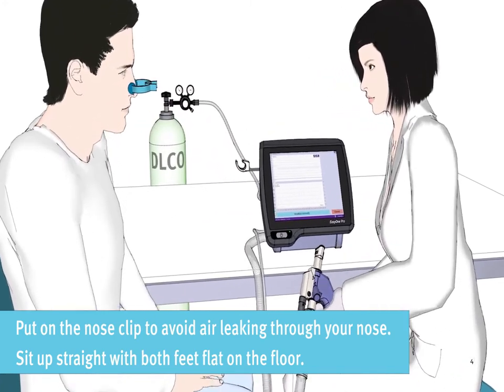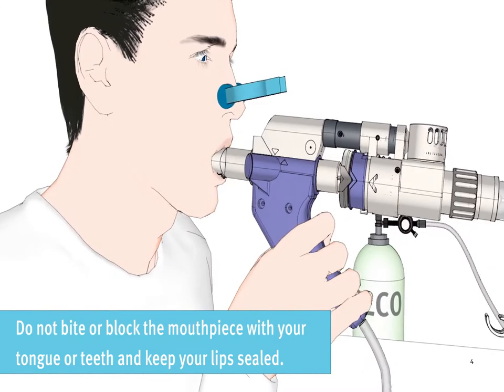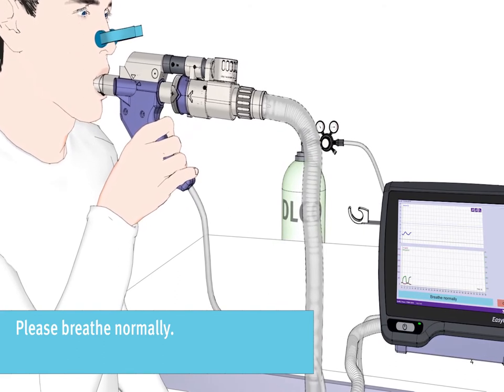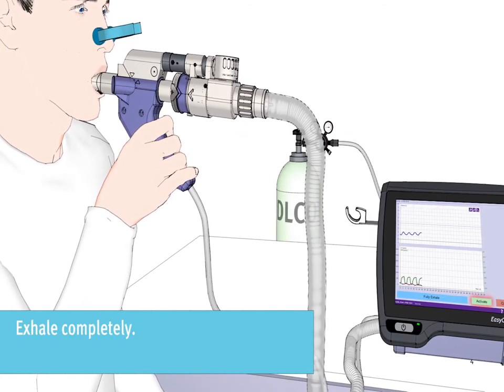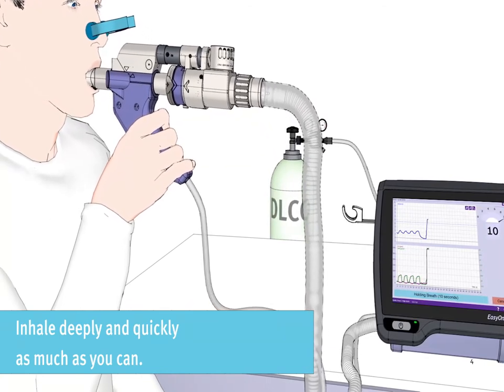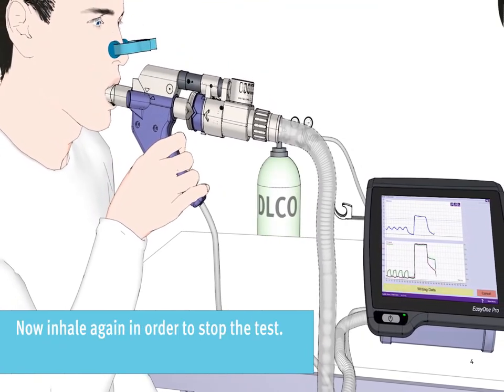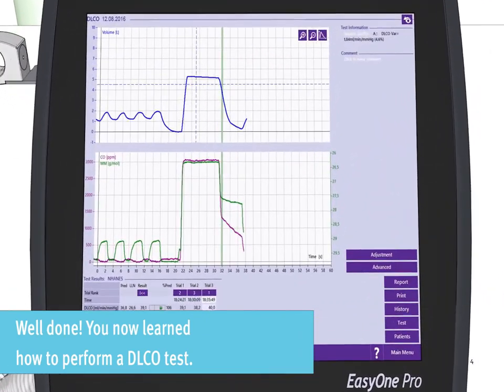Please sit up straight with both feet flat on the floor. Place your teeth around the mouthpiece and close your lips. Do not bite or block the mouthpiece with your tongue or teeth and keep your lips sealed. Breathe normally, then exhale completely. You will be asked to take one deep breath of test gas — inhale deeply and quickly as much as you can. Hold your breath for 10 seconds, then exhale quickly for about 3 to 5 seconds, then inhale again to stop the test. Well done — you now know how to perform a DLCO test.